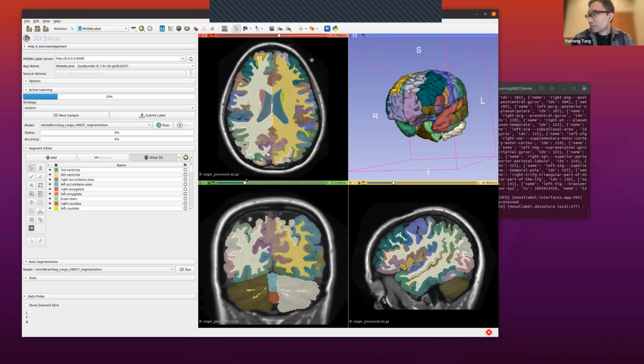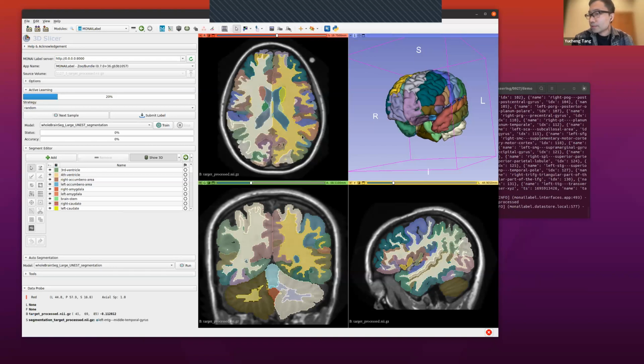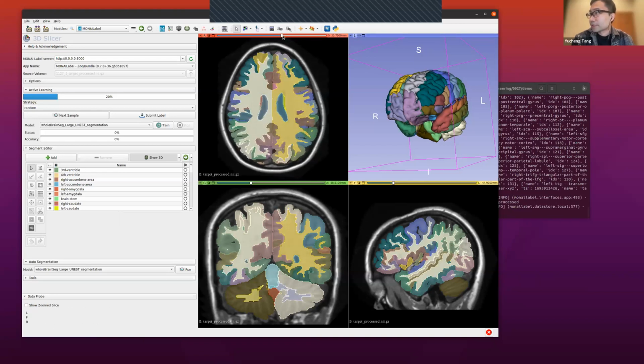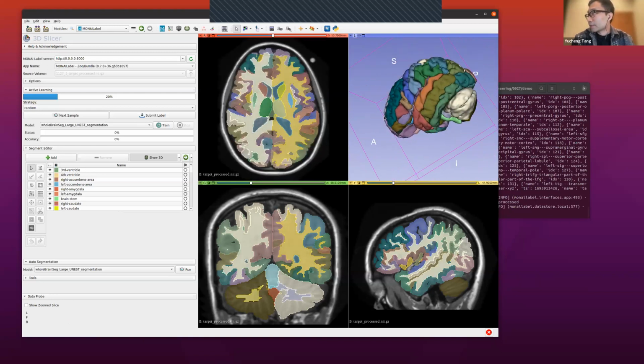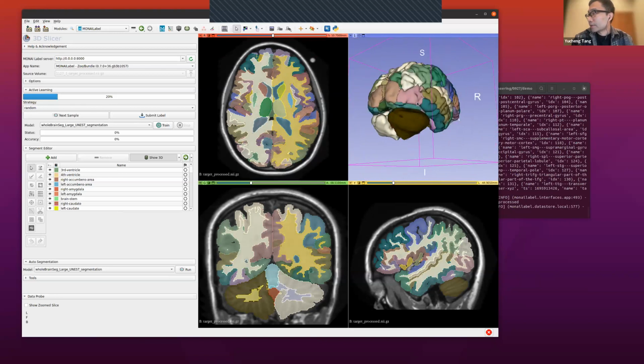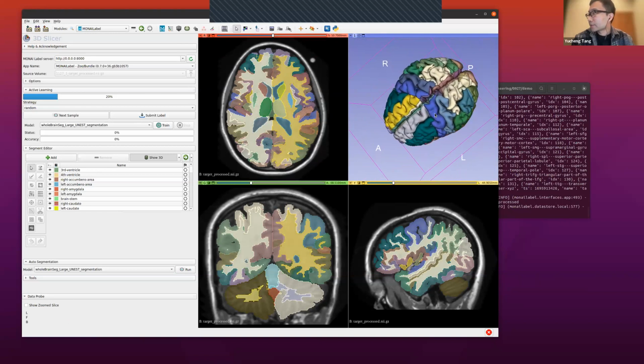We don't say it perfectly differentiates the boundaries of the interconnected structures, but it captures the boundaries and the interconnected details well. I think that's one of the advantages of our model compared to prior models. And you can see in the rendering that there are very good details. It can tell different tissues and sub-areas in the brain.